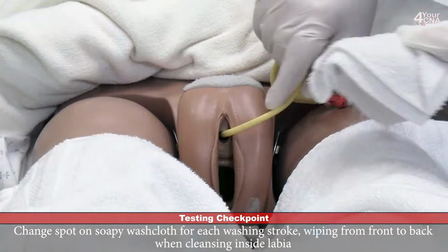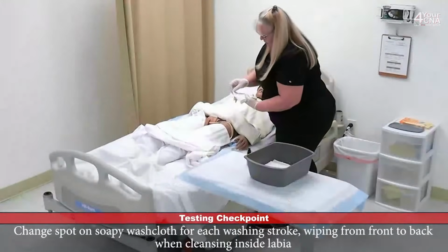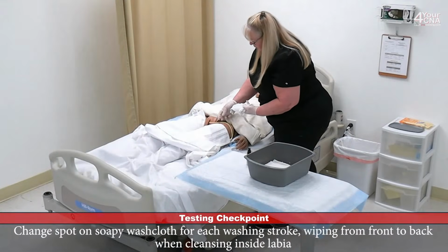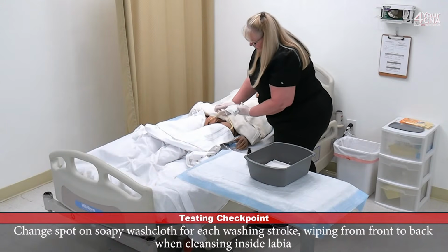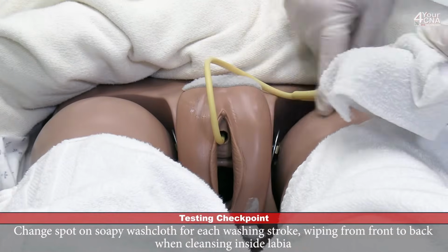The second leaf will wash the outside of the labia, top to bottom. We'll fold that leaf over. This is going in one direction only, top to bottom. This third leaf is going to wash the other side of the labia, top to bottom.